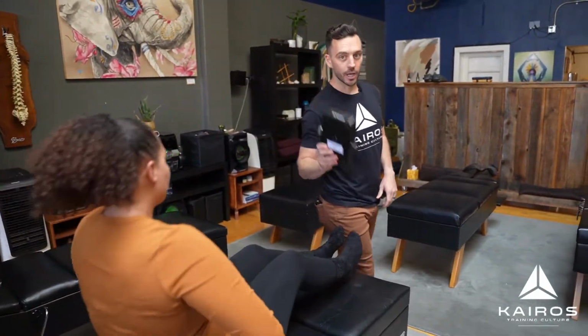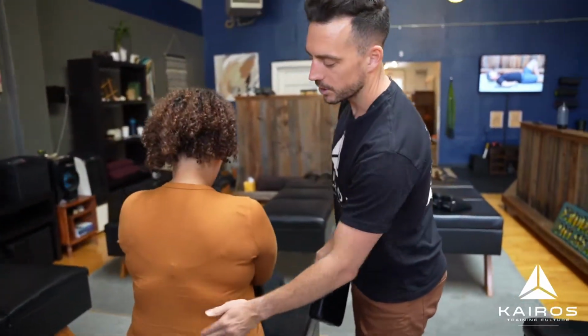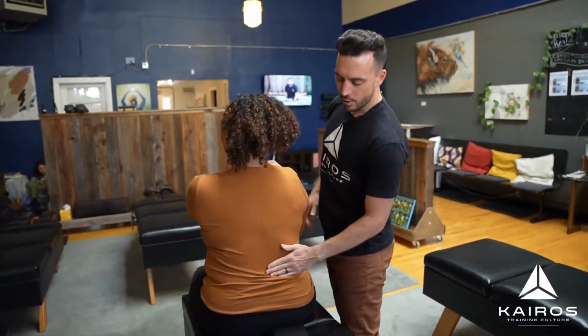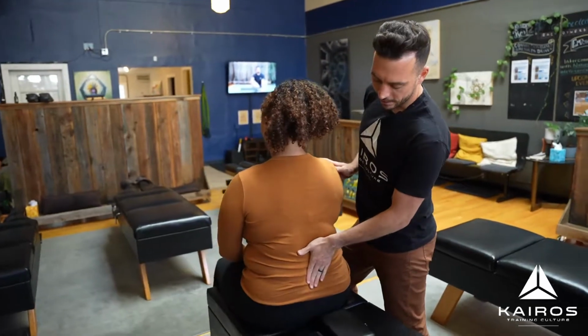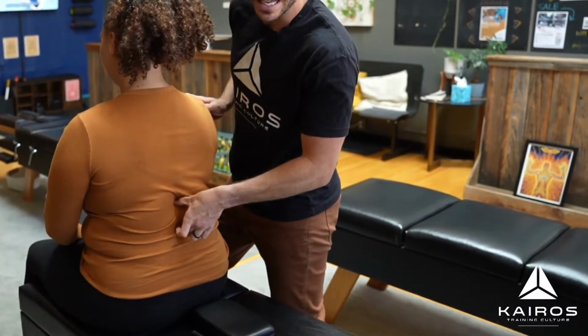Now, Savannah, I'm gonna have you sit up. I also love using this for an anterior dorsal of the lumbar spine. Can I have you scoot forwards a little bit more? And so typically I'll use this on somebody who has a hypolordosis in the low back with a lot of compression, most commonly closer to like the TL junction.